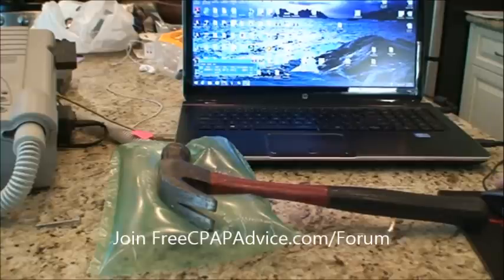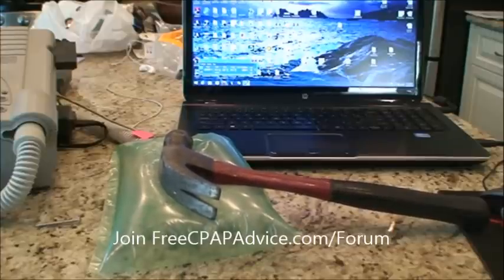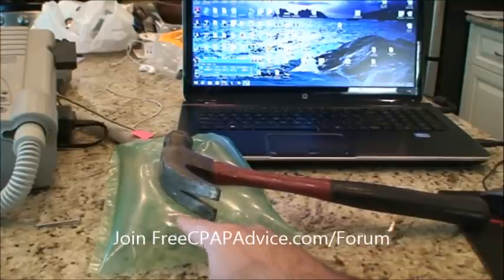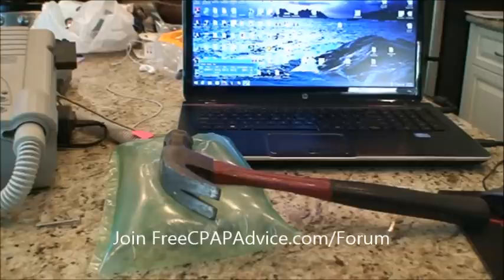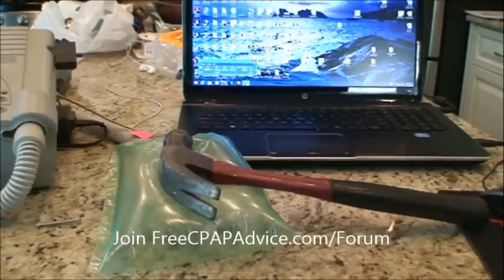So we're going to go ahead and increase more. We're trying to get this person to their therapeutic level. Now it's at 6. You can see there's still a collapse in the airway here. It's still dipping down a little bit. So let's go ahead and increase to 7.